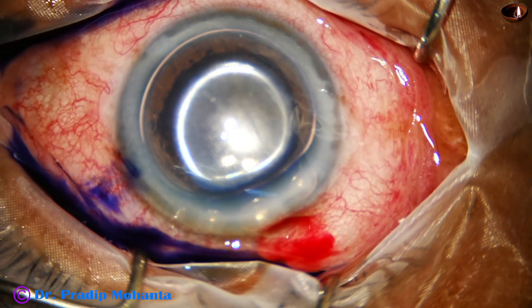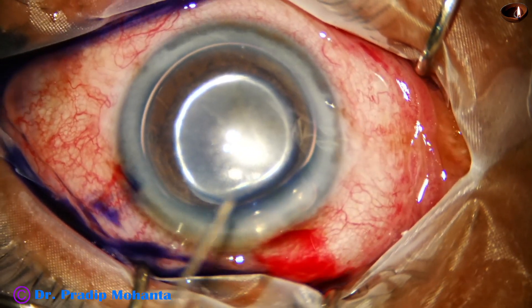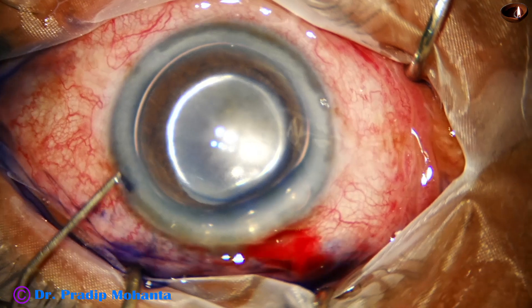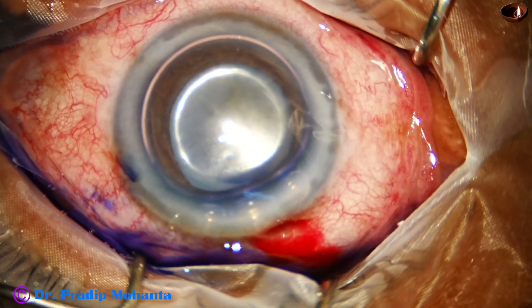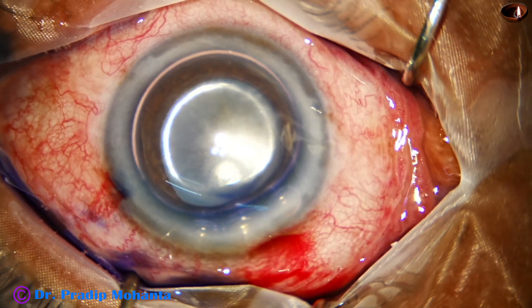An air bubble has been injected, and now trypan blue dye has been applied over the anterior capsule. The aim is to stain the anterior capsule so that capsulorhexis can be done comfortably.